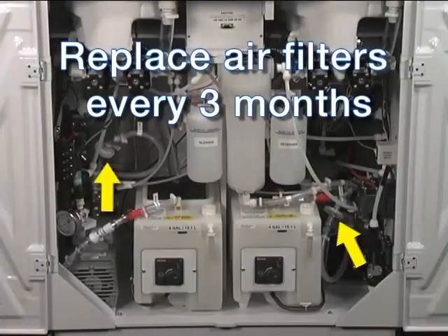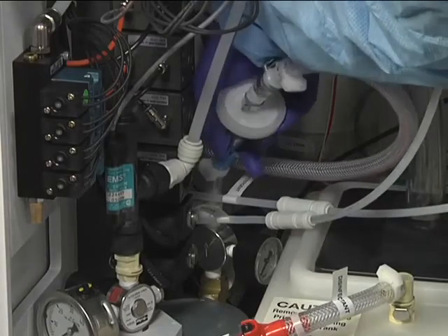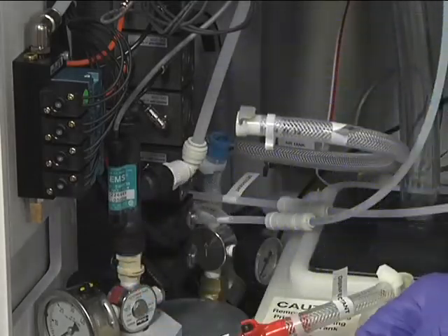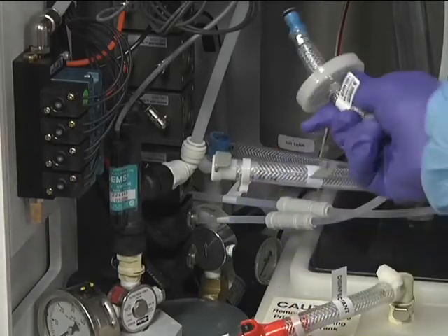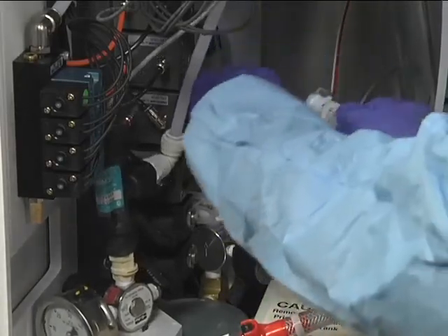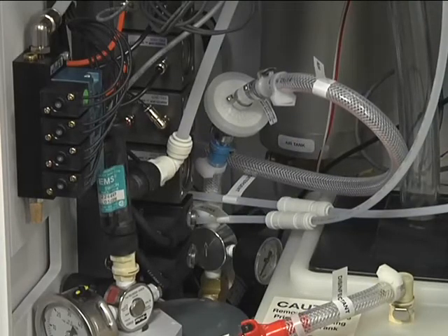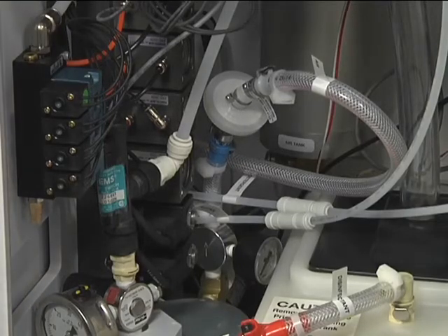Your DSD-201 system contains two air filters, one for each station, which should be changed every three months. The air filter is held in by a pair of quick-connect clamps. Remove the filter by pressing down on the quick connect and pulling the air filter out of the connector. Place the new filter in line, making sure it is oriented properly — the ends of the air filter and the quick connect clamps are color coordinated to assist with correct orientation. Place the blue end of the air filter into the blue quick connect and press it in until you feel it click. Repeat for the white end.